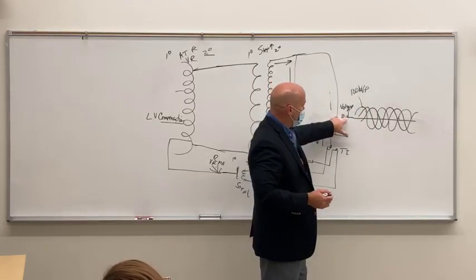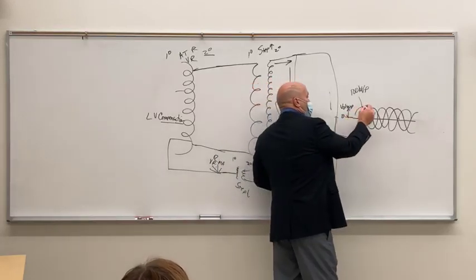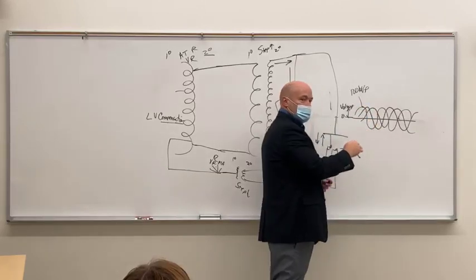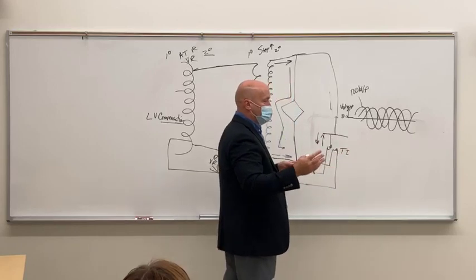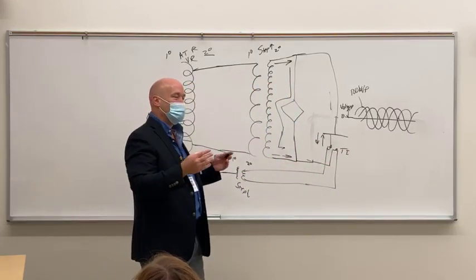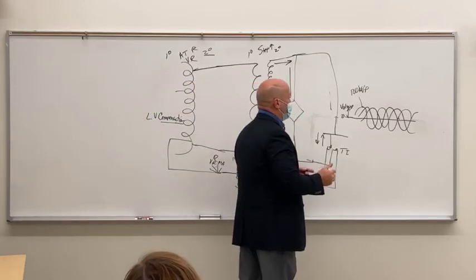That's going to be at 0. So what we do in doing that is our overall beam energy never drops to 0. Each pulse does drop to 0, but the overall beam energy doesn't. I'll talk a little bit more about that, as it gets us a little deeper into the semester here. I'll talk about that in a minute.